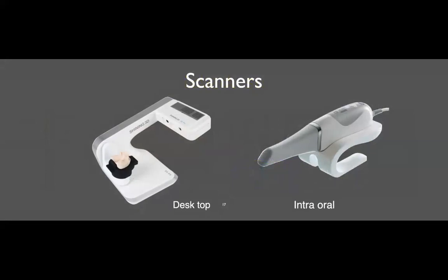Obviously, when it comes to the STL file, you have your options of an intraoral scanner versus a desktop scanner, and you can go ahead and scan. You guys have seen, you have multiple scanners in UFM, so that should not be an issue. I'm not sure if you guys are doing it routinely in PROS. I've actually seen some of the PROS students take impressions with the intraoral scanner while I was there.